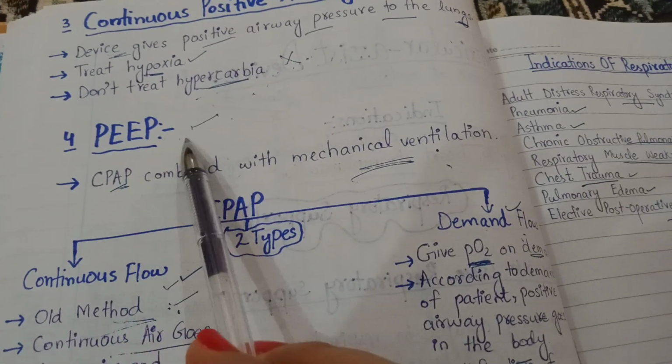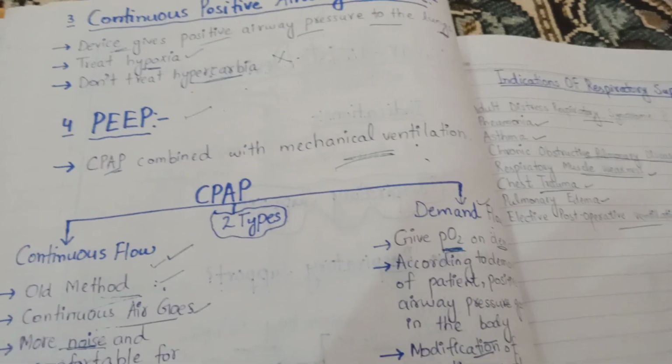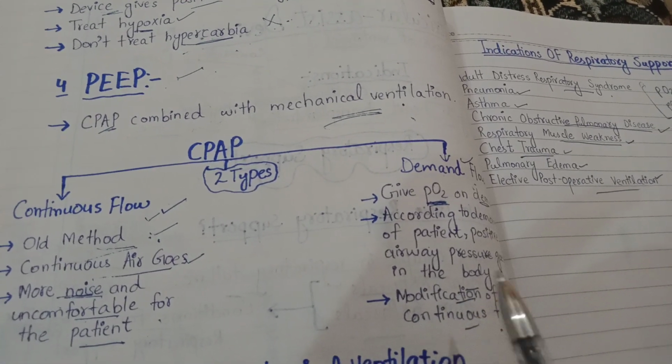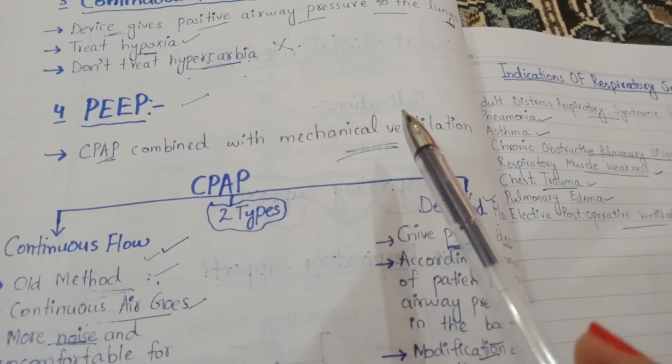Next type is PEEP. PEEP is CPAP combined with mechanical ventilation, meaning in CPAP, as I have told you, it will never assist the work of breathing, but in PEEP it will assist the work of breathing.